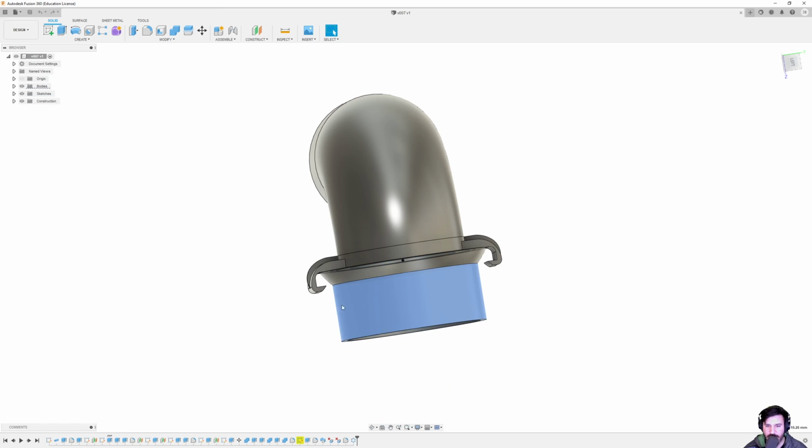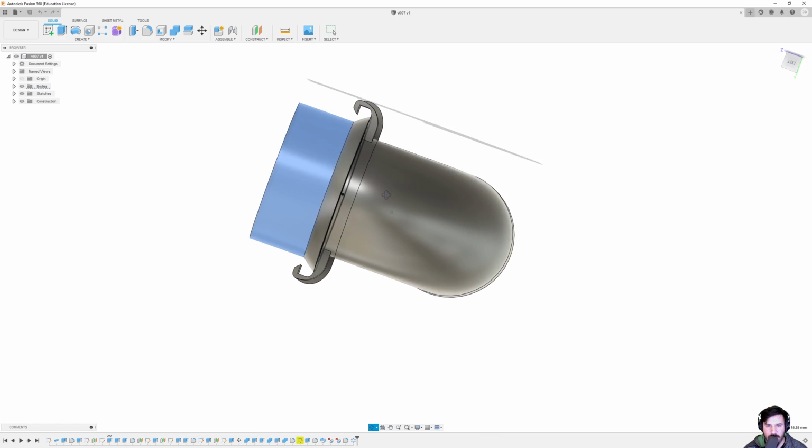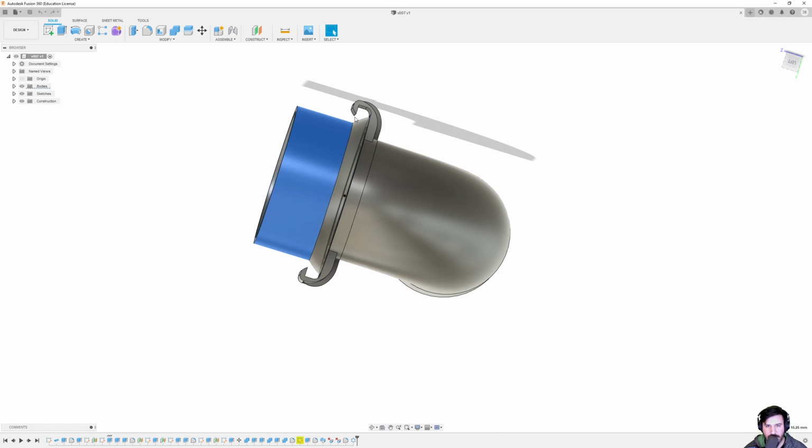Initially I had made this a friction fit with that mask, which they were okay with. They were happy with that, and the hooks, the clasps, whatever you want to call them, were there, but they would not do great. They would break off very easily, and part of that was due to me having that purple PLA. It was very old, and it's absorbed a lot of moisture, so it's very brittle. So while it still prints, it functionally doesn't work quite as well.